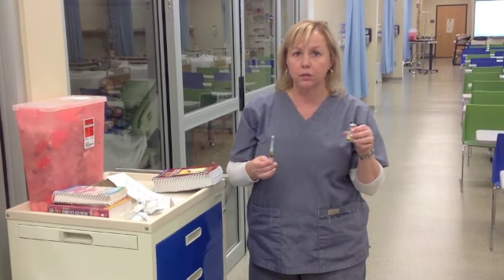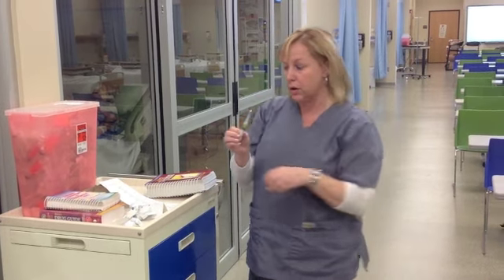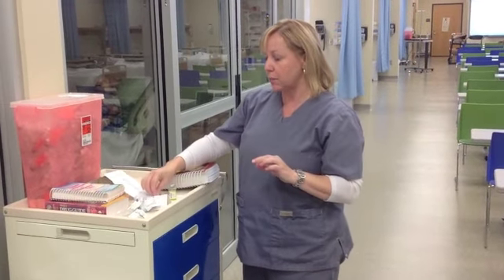Again, that's the same dosage, so we would use D over H times Q, and in this case I'm going to end up drawing up 1 milliliter. So I've got 1 milliliter already drawn up in my syringe because I've already done all the math calculations.